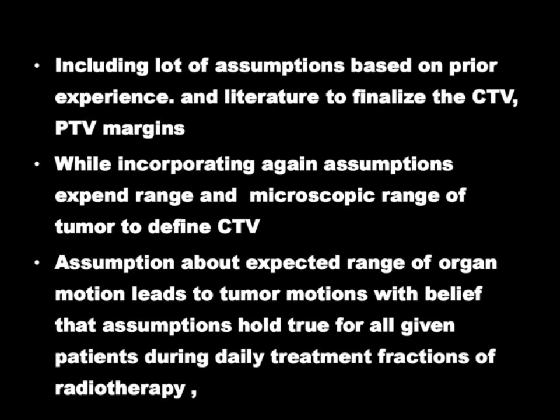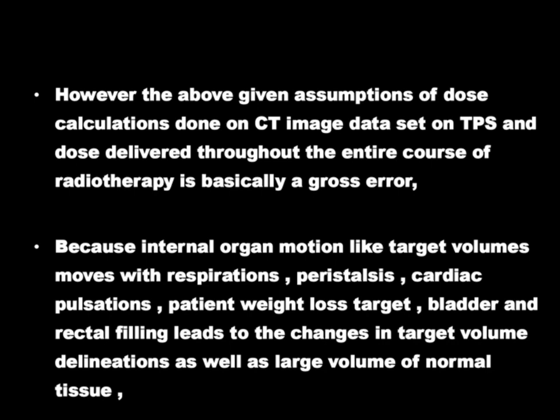So there is an entity called in-room imaging technologies. This very technique helps in obtaining the target volume, position and its movement during the treatment and in between the treatment, that is intrafractional or interfractional. So in-room imaging uses a reference image and applies methods to correct the target volume and patient setup error in order to get an optimized target localization.